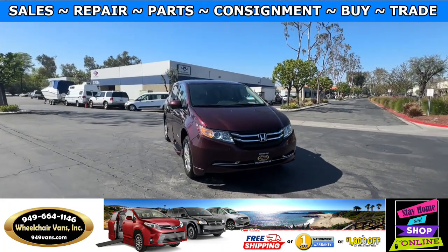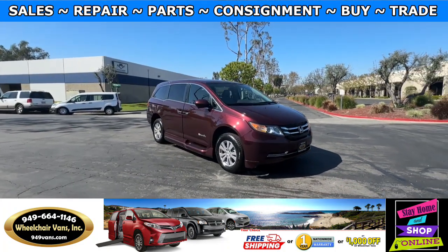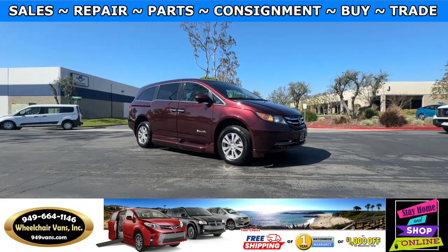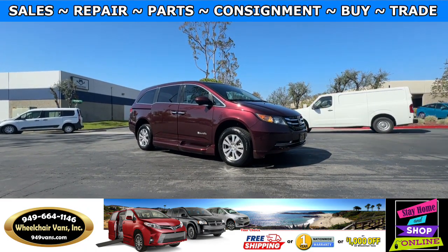Hello and welcome to Wheelchair Vans Inc. Today I'll be going over a 2014 Honda Odyssey equipped with the BraunAbility Power Foldout Ramp.